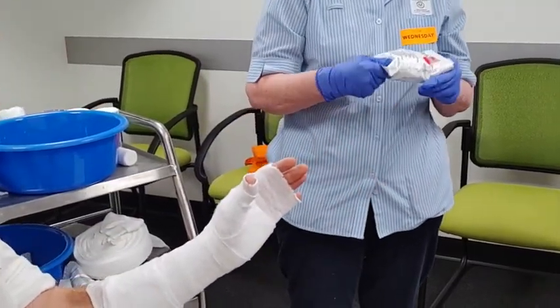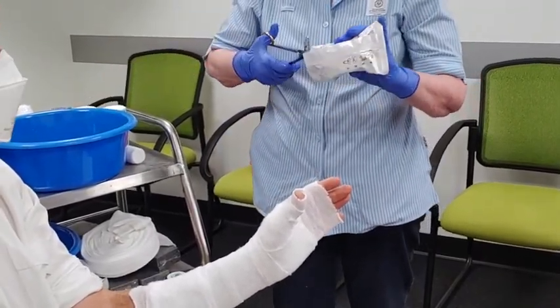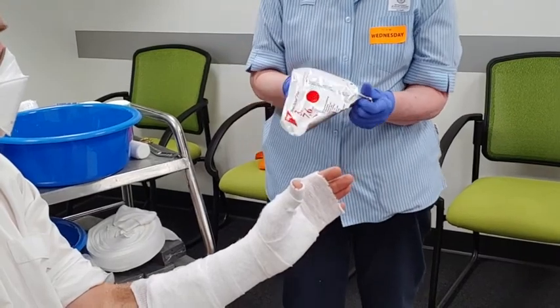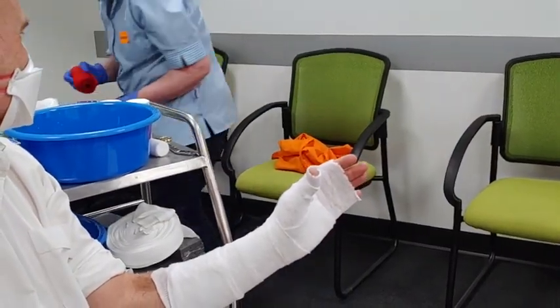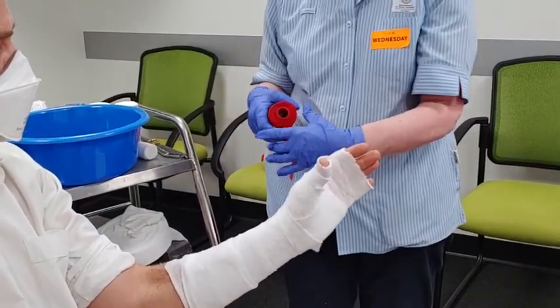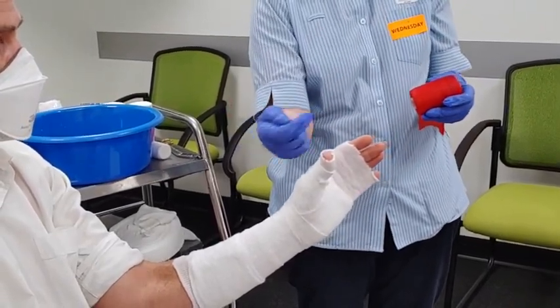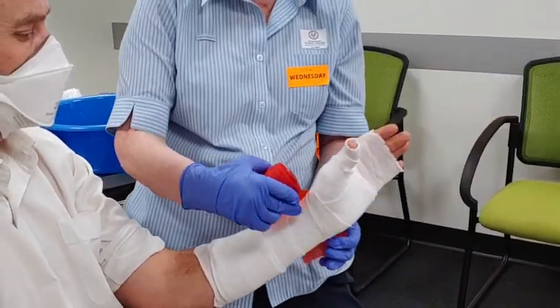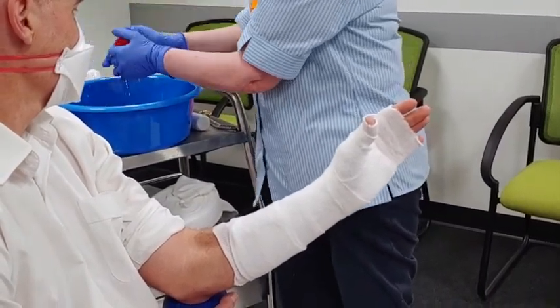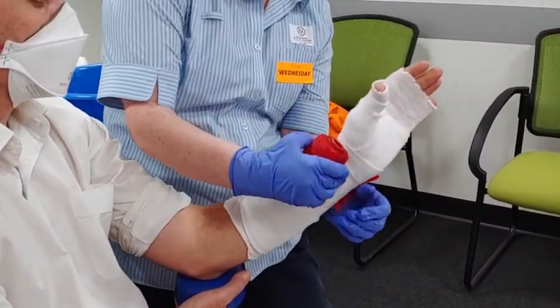If you're a beginner with this product and you're unsure, you can apply it dry — it gives you a lot more time before it sets. If you've got time and you're not sure what you're doing, just apply it dry. For this demonstration, we start at the wrist with the scaphoid cast. It's safer to go around at the wrist first so you don't pull it around too tight and ring-bark the hand. Give it a little squeeze — it doesn't need too much water — and start at the wrist.